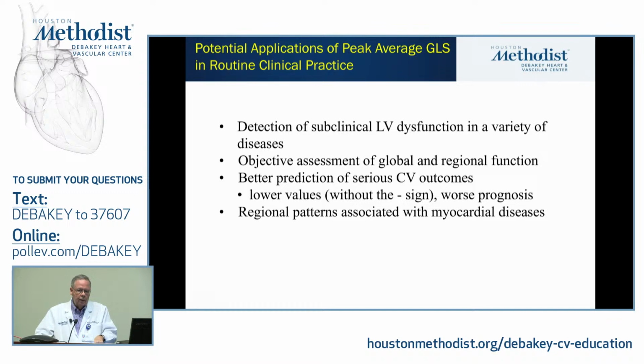And that's why if you look at some of these papers that were written for normal values, they recommend having an eye on blood pressure, because a person with a 180 systolic at the time of the echo could potentially have a lower value than perhaps if the blood pressure was 120. So, it's not a bad idea to keep an eye on that blood pressure.